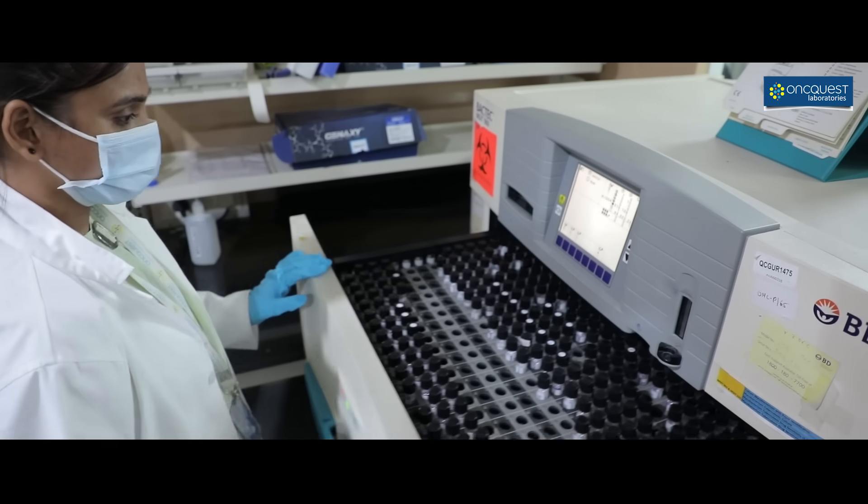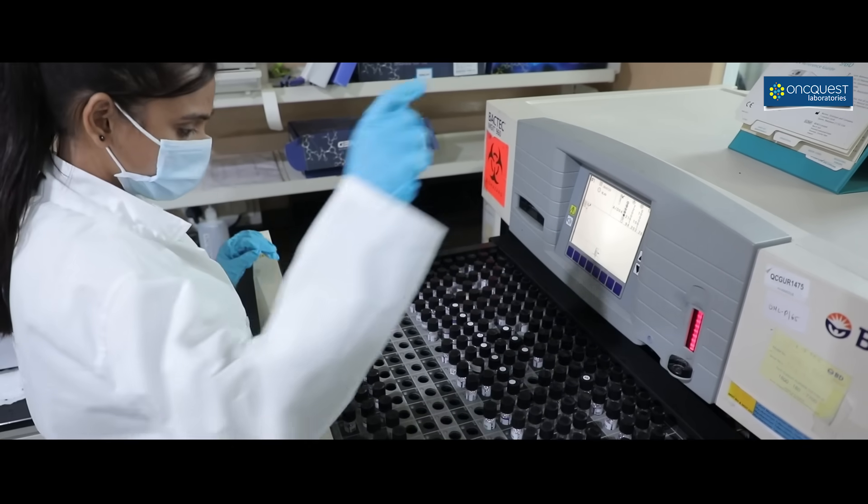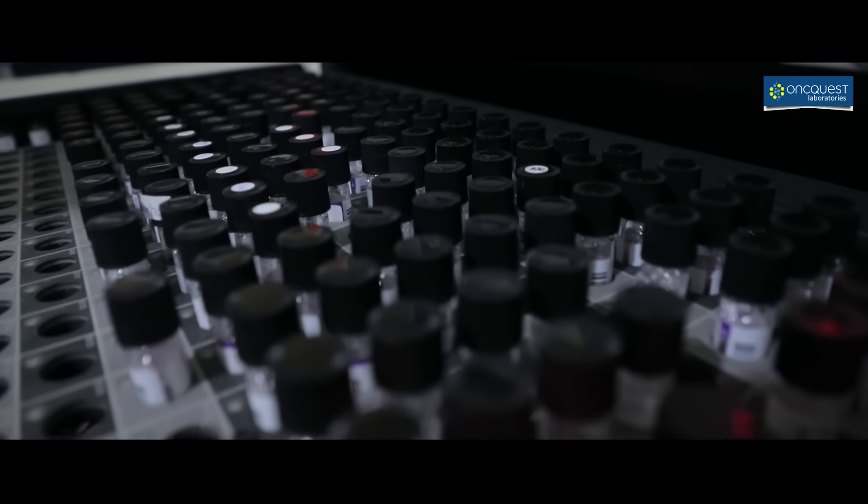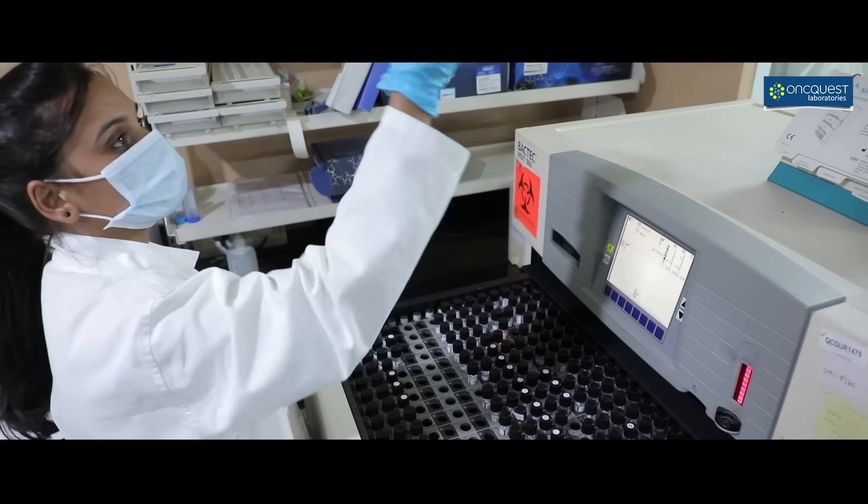MGIT is an automated mycobacterial culture system for mycobacterial growth detection and susceptibility with high throughput. More than 900 samples can be tested in a single instrument. It is more sensitive than conventional solid media and reduces turnaround time to 10 days as compared to 28 to 42 days with the conventional method.